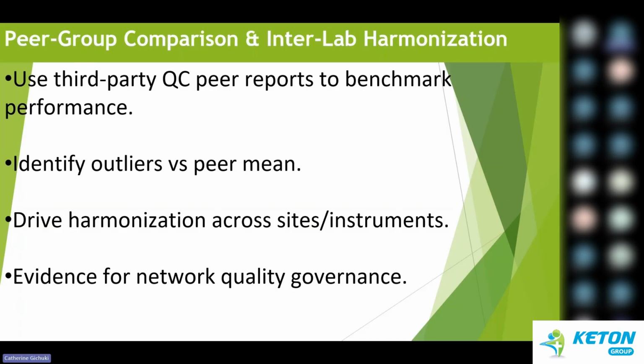If you look at the standard, we've talked about comparability. You're able to do that even when you have two platforms in the same lab, comparing one to the other. We are going to do this by benchmarking against other labs. We use third-party QC peer reports to see how our results compare with similar labs that are using the same methods.